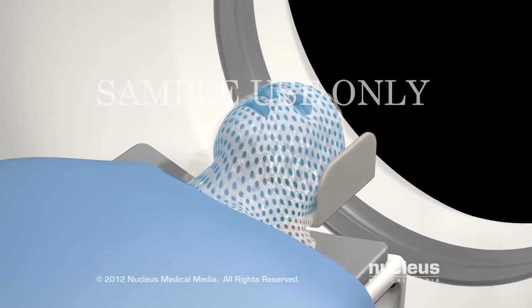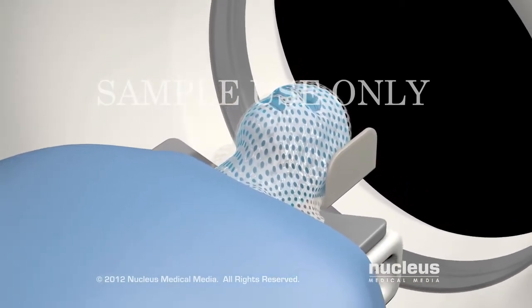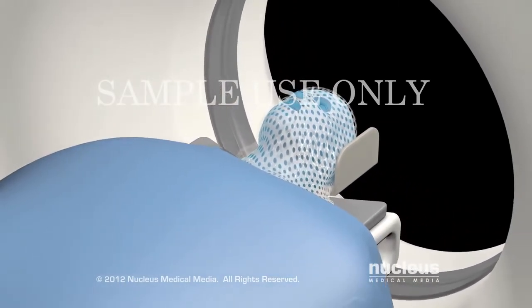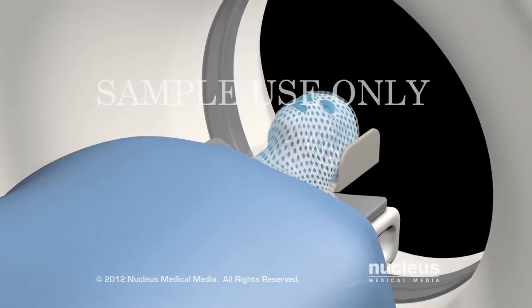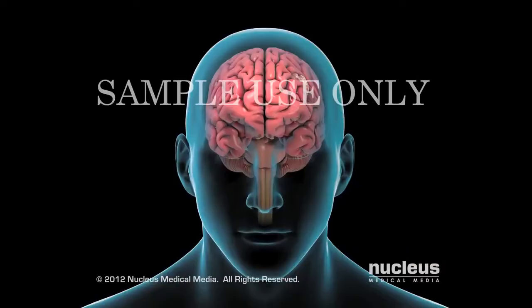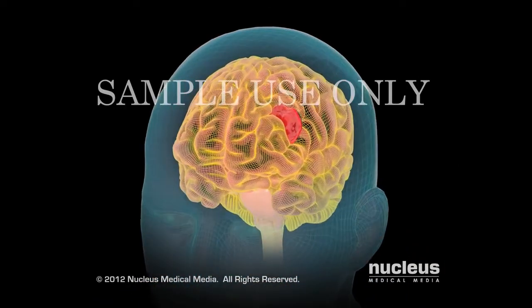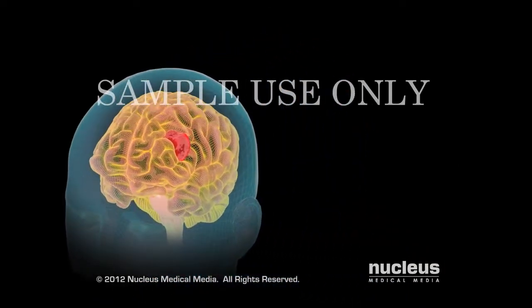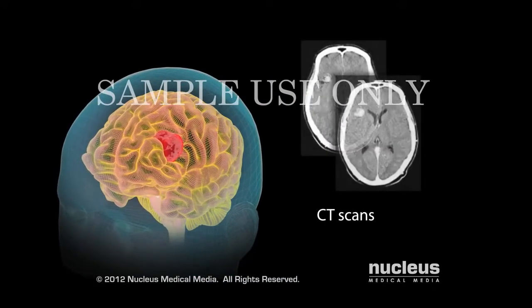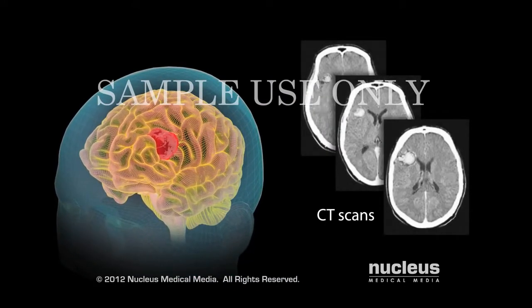Next, your therapist will do a CT scan of your head to get a detailed picture of your tumor and its borders. Your doctor will use the scans to specify the three-dimensional shape of your tumor and vital tissues nearby.